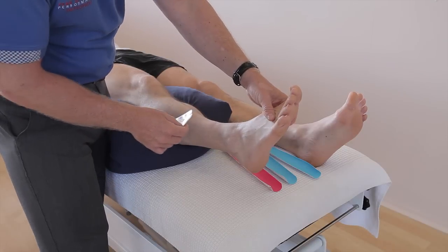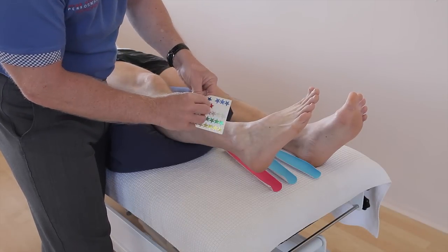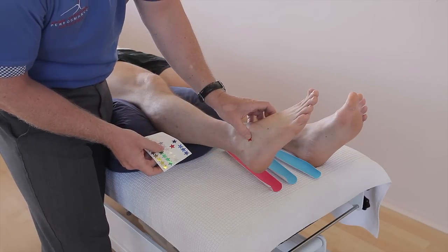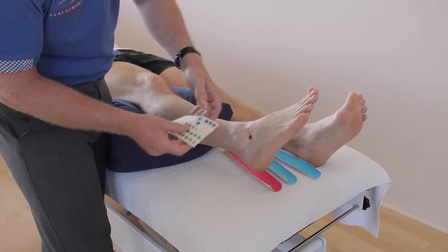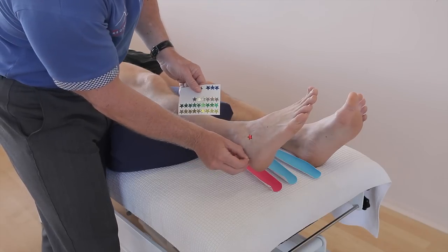Patients presenting with an ankle inversion sprain tend to have pain localized to where my finger is. If I just mark that with a sticker, this would be known as the anterior talofibular ligament, commonly known as ATFL for short. And there's another ligament there called CFL, which is known as the calcaneofibular ligament.